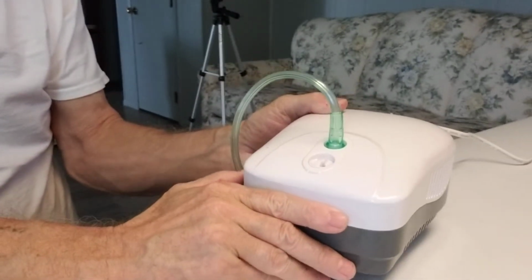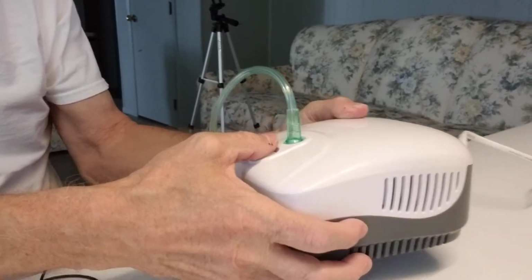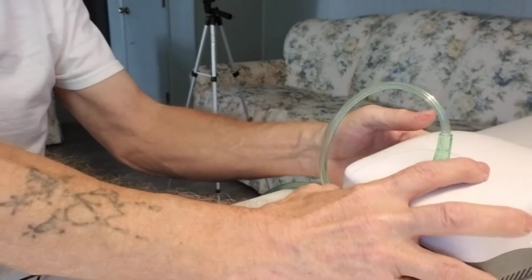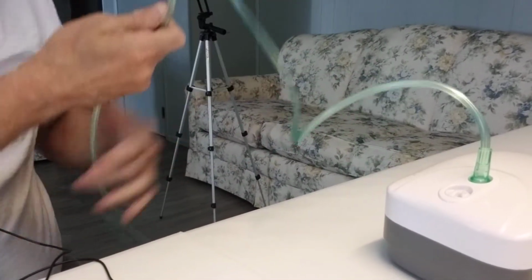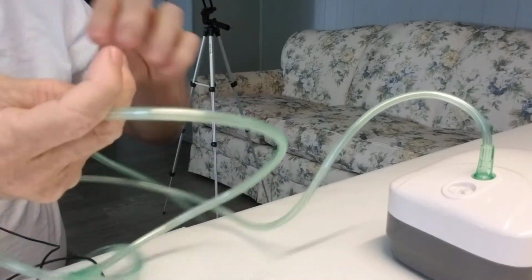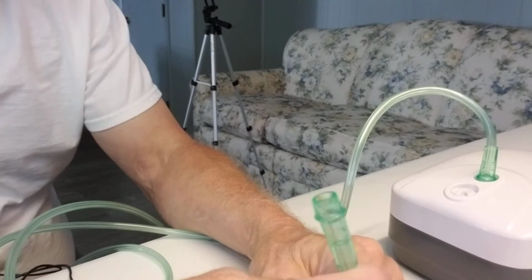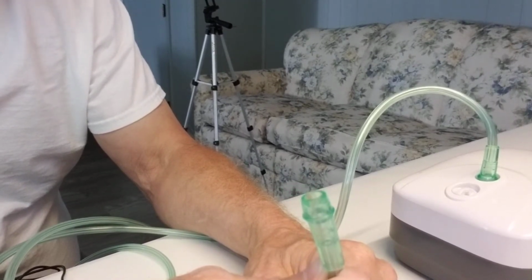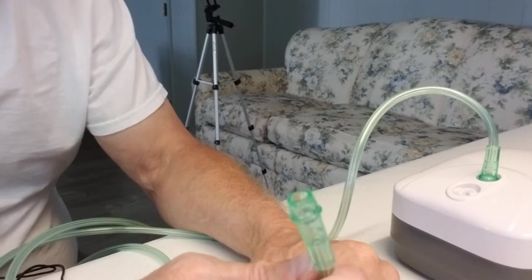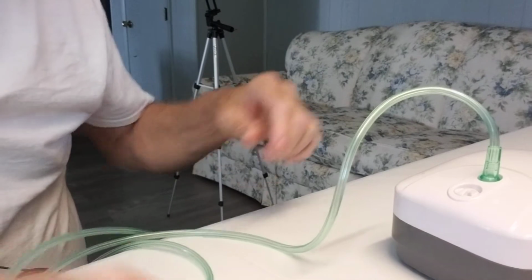You turn it on. I'm sure you can hear that. What it does is it takes air into the machine. It pumps it out through this hose. And in turn, the medication that's put into it becomes liquefied into a mist, and that's what you breathe. Okay, I'm going to simply show you some of the parts.